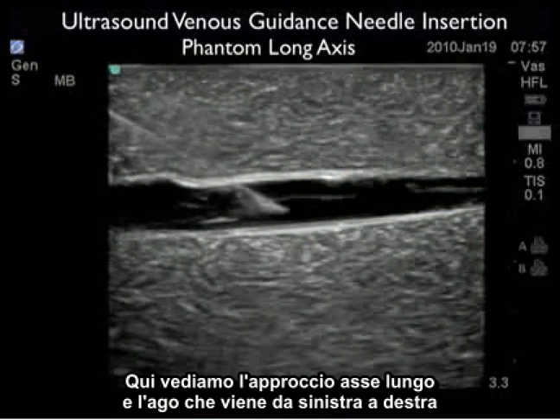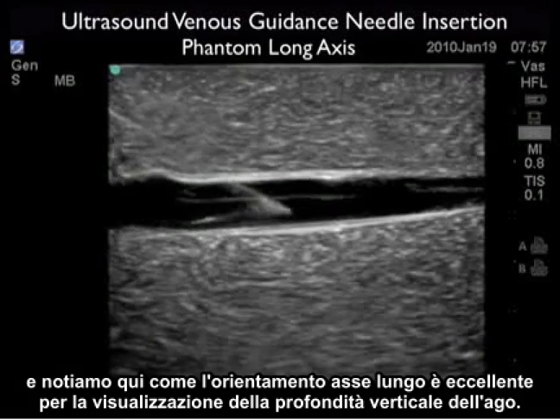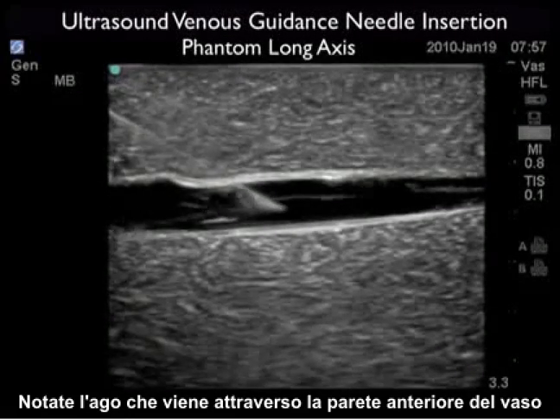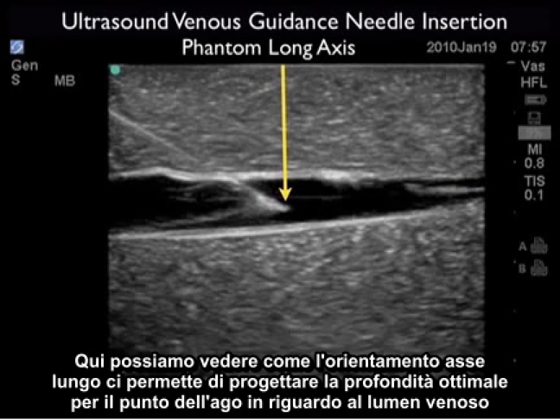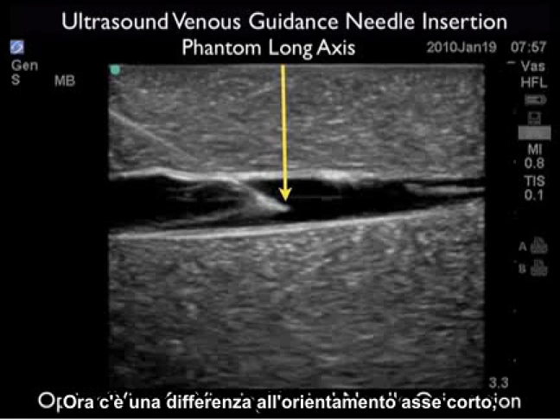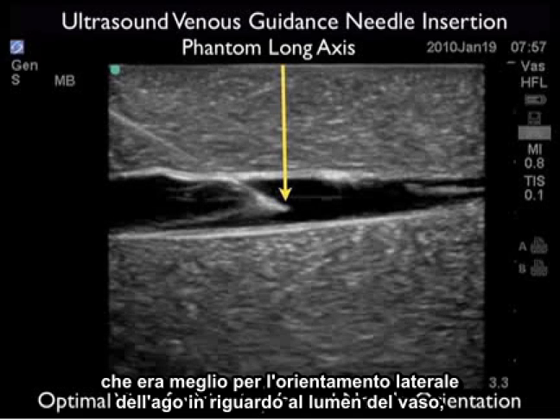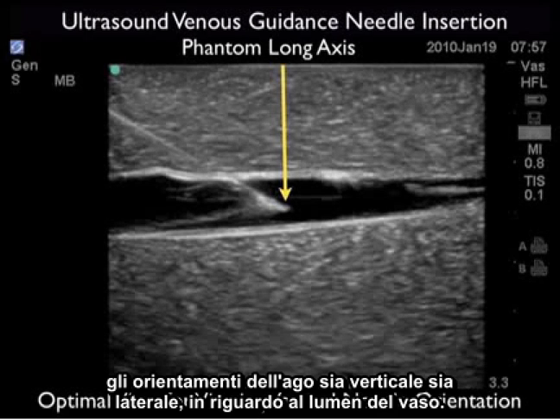Here we see the long axis approach and the needle coming in from left to right, and we note how the long axis orientation is excellent for seeing vertical needle depth. Note the needle coming through the anterior wall of the vessel and now the needle tip squarely within the vessel lumen. Here we can see how the long axis orientation allows us to plan the optimal depth for the needle tip with regard to the venous lumen to squarely secure a cannulation attempt. This is in contrast to the short axis orientation which was better for lateral needle orientation with regard to the vessel lumen. So using a combination of short and long axis orientations will allow you to see both lateral and vertical needle orientations with regard to the vessel lumen.